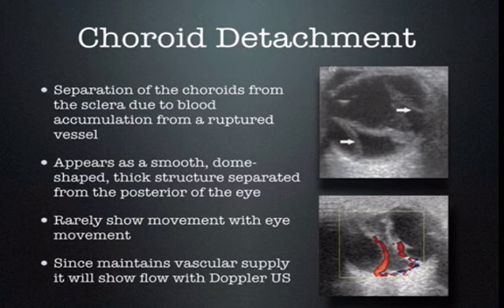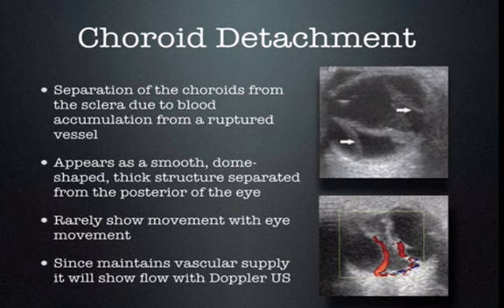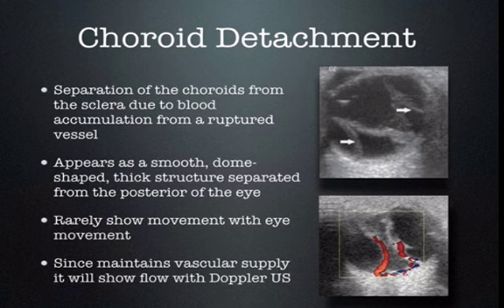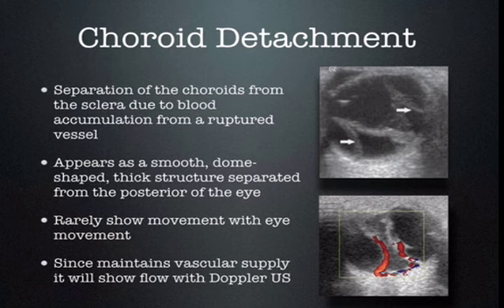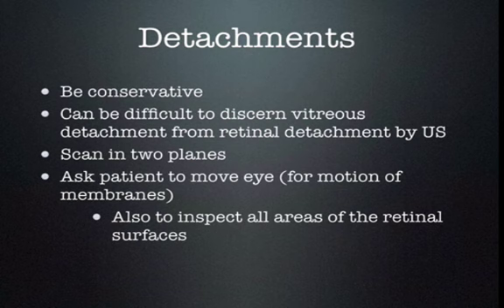Choroidal detachments are the deeper layer of the eye and are not as thin or flexible as just the retina, because the retina lays over the top of the choroid membrane. When the choroid separates from the posterior parts of the eye, the retina is involved too, so it's usually thicker, easier to see, generally domed, and doesn't move with eye movements. However, an old retinal detachment may also dome and not be movable. Fortunately, the choroid has the blood supply to the retina — so if you turn on Doppler, you'll see blood supply in the choroid detachment. You do not see blood supply with a retinal detachment because the choroid is not detached. Use Doppler ultrasound to confirm a choroid detachment.